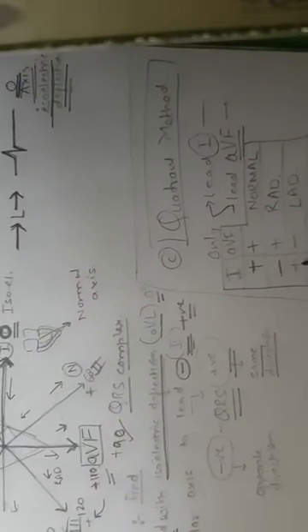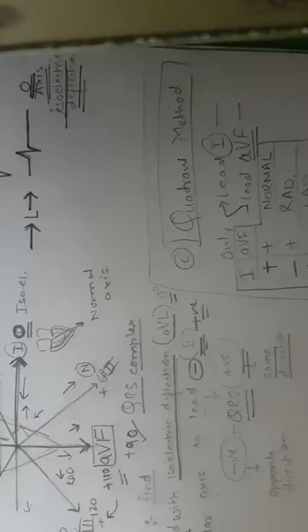If lead 1 is positive, and AVF is negative, the current is in this direction, so there is left axis deviation. If both are negative, it is going away from lead 1 as well as AVF, which means it is extreme deviation. This is how we find it by the quadrant method. So these are the approximate methods: first is the hexa-axial method, second is the quadrant method.